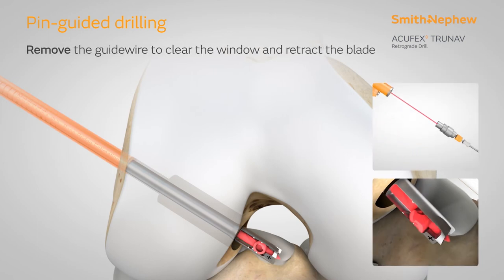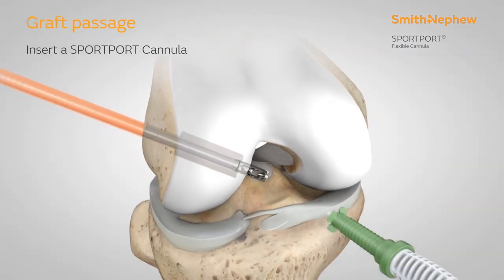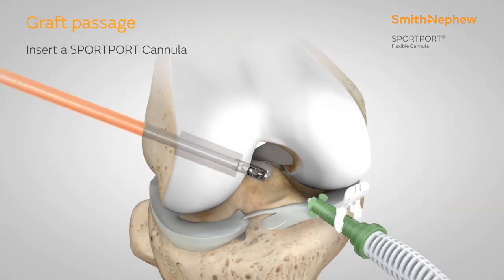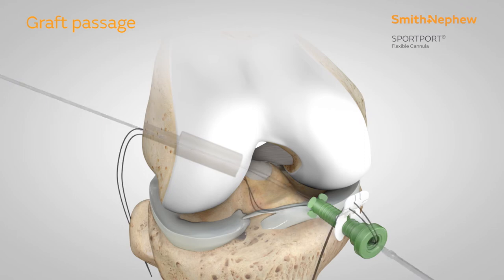Once drilling is complete, advance the drill back into the notch. The drill may then be detached, the guide wire removed, and the retrograde blade retracted. With a sport port cannula inserted, the suture passer can be passed down to the cannulation of the TrueNav drill and pulled out through the sport port and docked for later use.